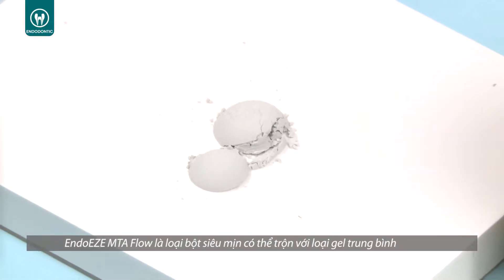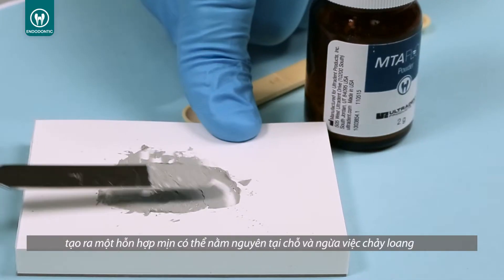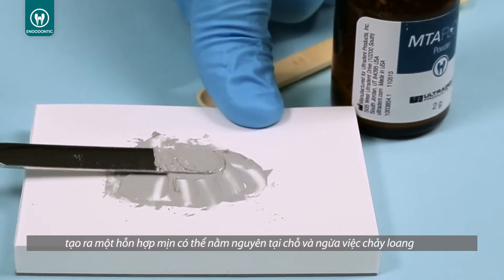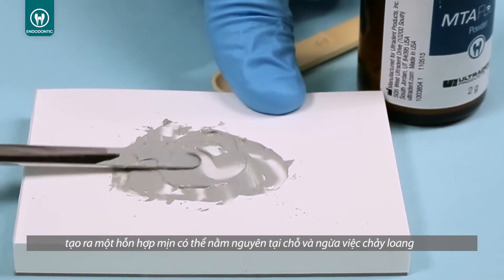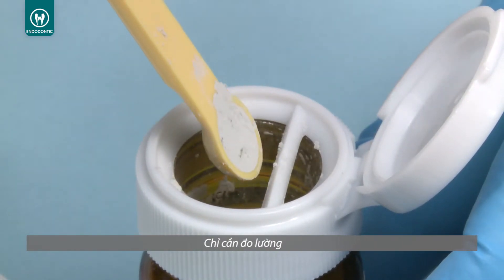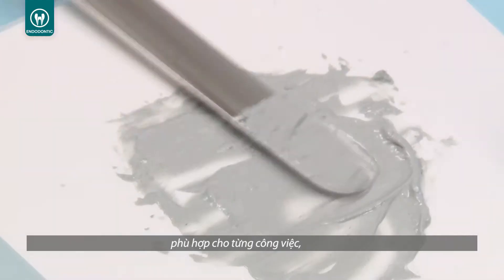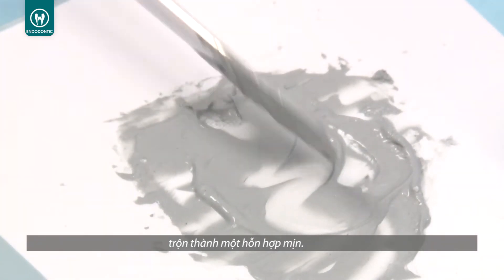The EndoEase MTA Flow Ultrafine Powder and Proprietary Gel Medium creates a smooth consistency which stays in place and helps prevent washout. Using MTA Flow is easy — simply measure the appropriate amount of MTA powder and gel needed depending on the procedure, and mix to a smooth consistency.